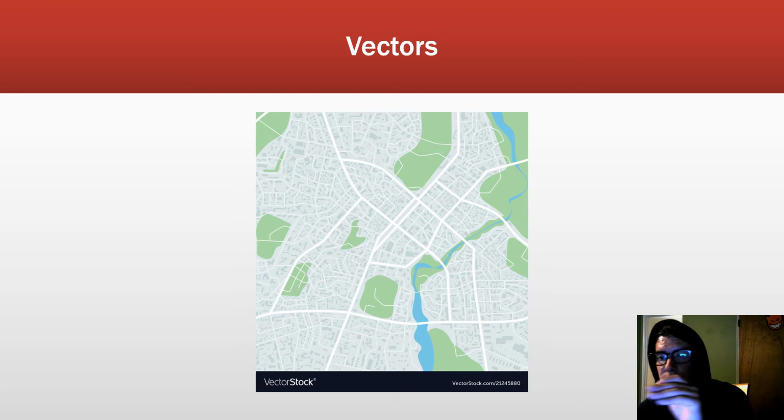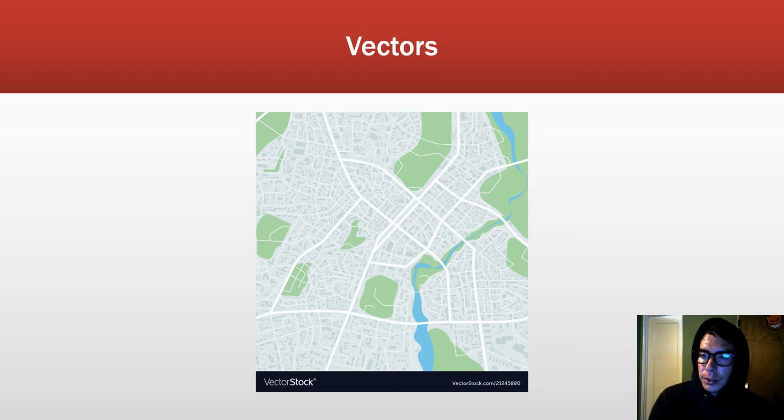Like if it's going from east to west, it's not going to stay going west. You might have to turn to the north and go up or down. What a vector is, is the overall direction. So overall, the plane is still going west. That's the route it's going. It's just not always going exactly west. But the overall vector, as it would be called, is a westward vector.